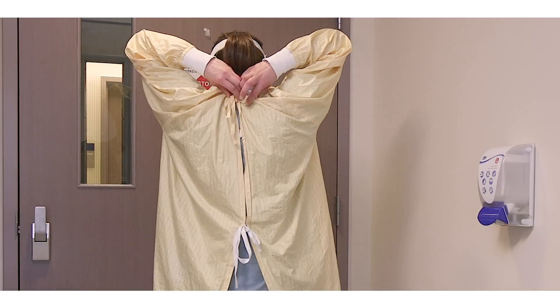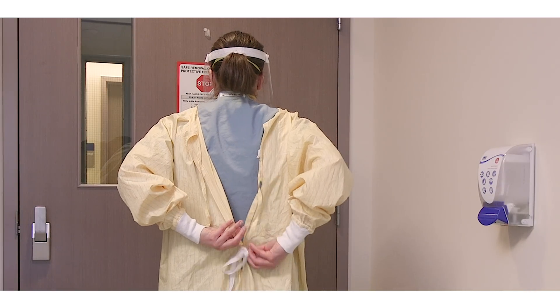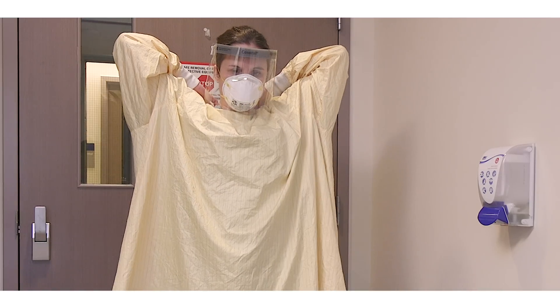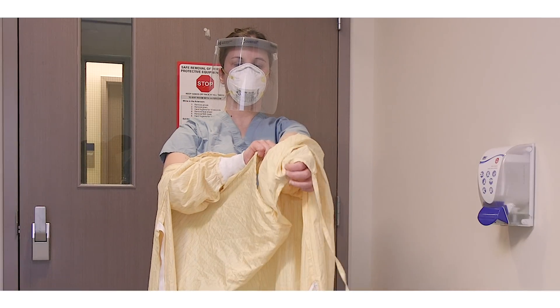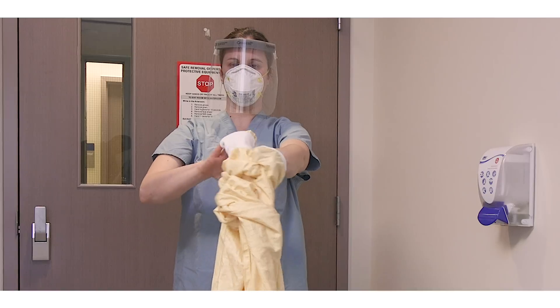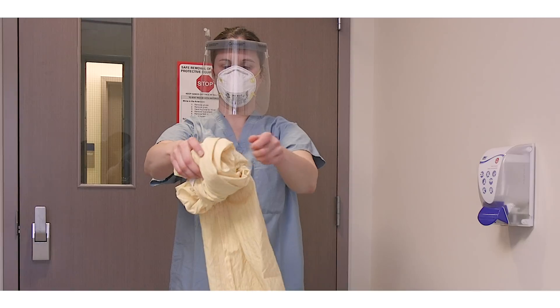You may perform hand hygiene at this time if there is any concern your hands became contaminated during glove removal. Next, untie the gown around your waist and at the neck. Grab the straps from the back of the neck and slowly pull the gown forward and peel it away from you, touching only the inside of the gown. Be careful not to let the gown touch your clothes. Roll the gown into a ball. Place a reusable gown in the laundry hamper, or if using a disposable gown, dispose of it in the garbage.